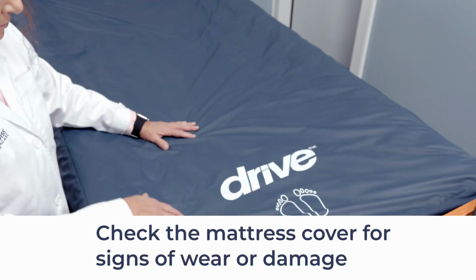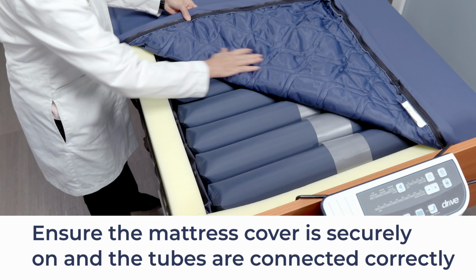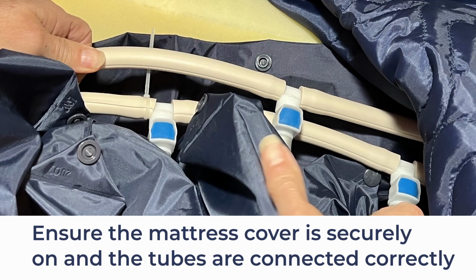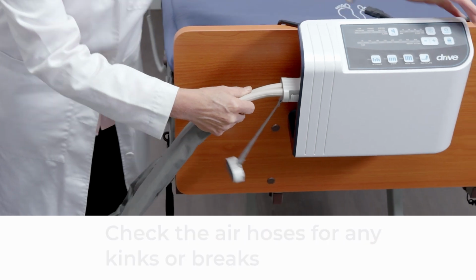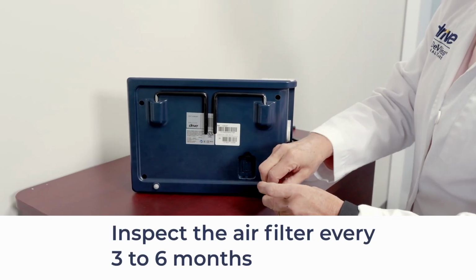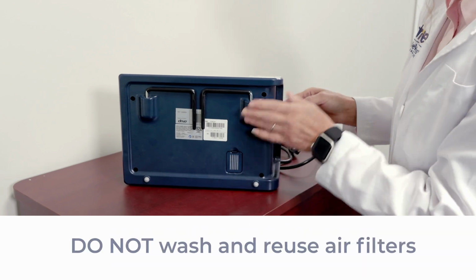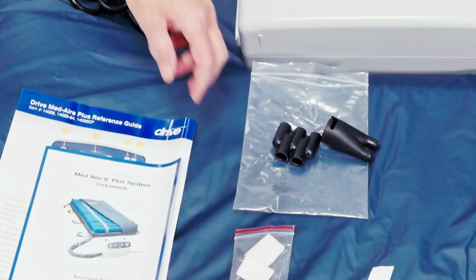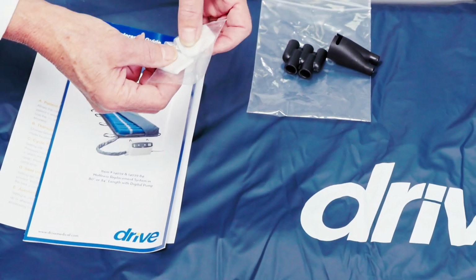Check the mattress cover for signs of wear or damage. Ensure the mattress cover is securely on and the tubes are connected correctly. Check the air hoses for any kinks or breaks. Inspect the air filter, located on the right side of the control unit, every 1 to 2 months. Do not wash and reuse. Every Preserve Tech MedAire Edge is shipped with 3 extra replacement air filters.